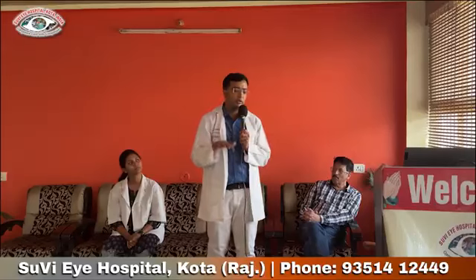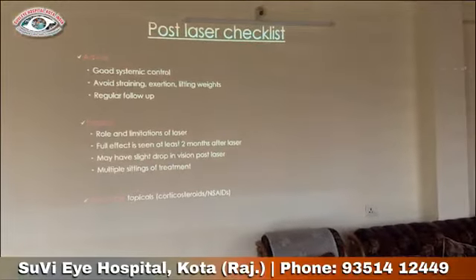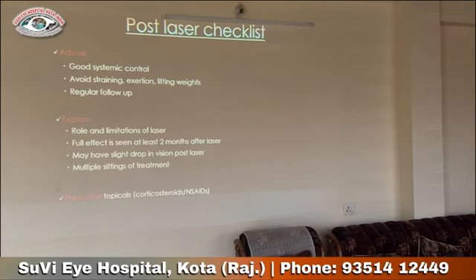One more patient, sir, I remember, was very apprehensive. She came with her young student brother, and she had one isolated single lattice with holes, but she was very scared, very anxious actually. So whenever I put the lens in, she squeezed her eyes and the lens would come out. We tried it 2-3 times, and even lying down in the supine position with LIO, but she was very uncooperative.